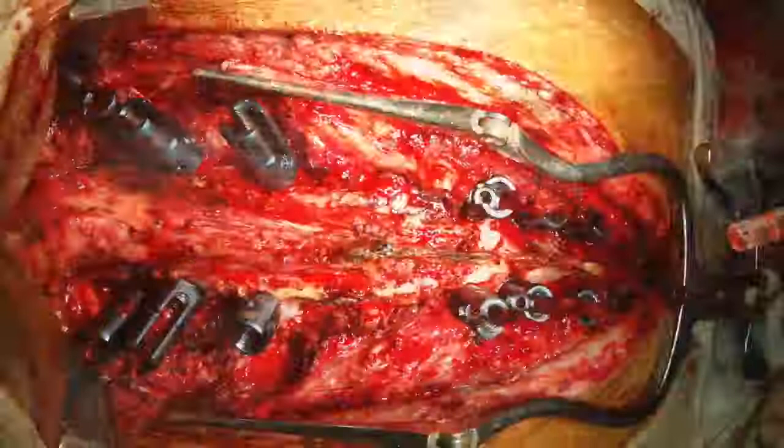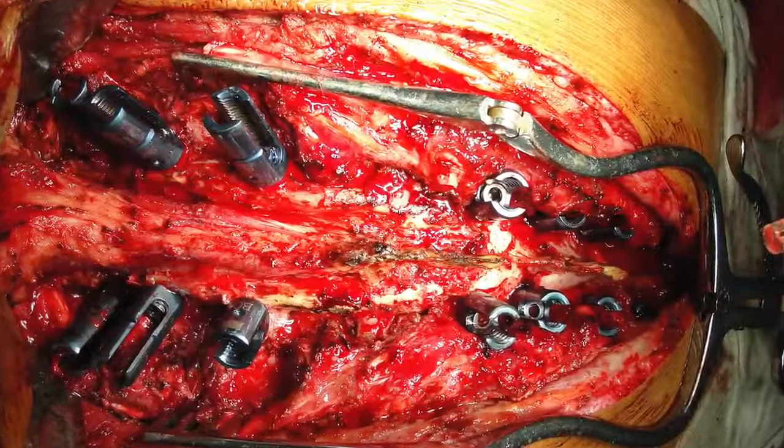Polyaxial reduction screws were placed in T2, T3, and T4 to help ease rod capture and reduction of the kyphosis after osteotomy.